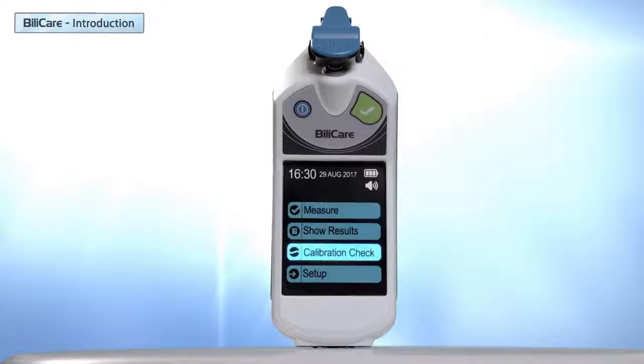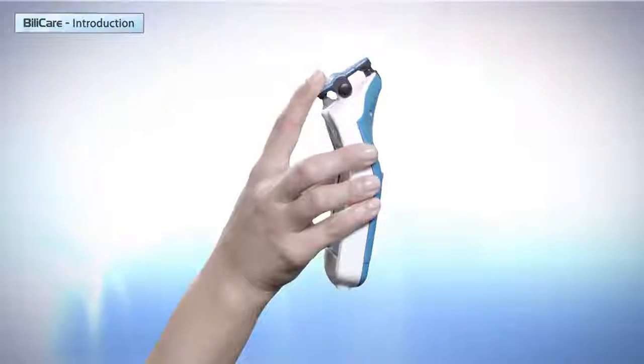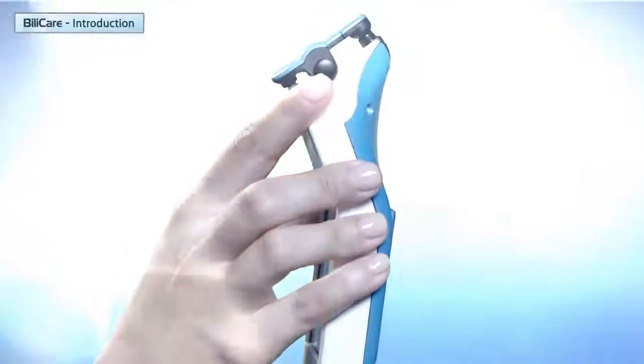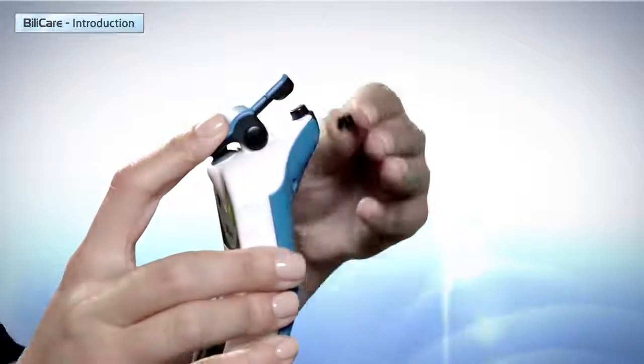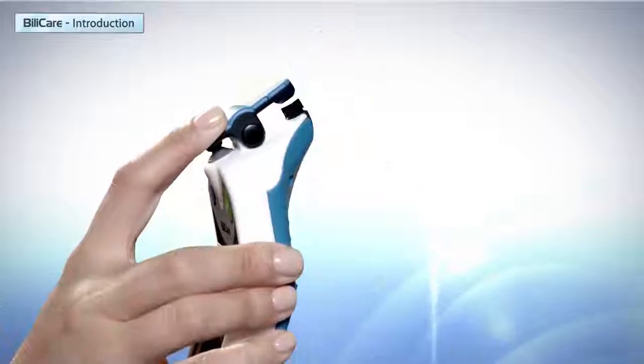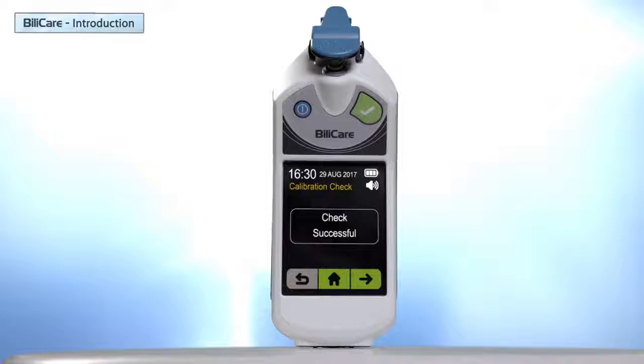Let's press Calibration Check. This procedure verifies that Bilicare is working properly. Follow the instructions on the screen. The first screen asks the user to close the clip, meaning no tip or cover should be on the sensor. Click next. The next screen asks the user to place the calibration check tip on the sensor, then click next. If Bilicare works properly, the check successful screen is displayed. If the check failed, the check unsuccessful screen is displayed and the device should be sent to service.